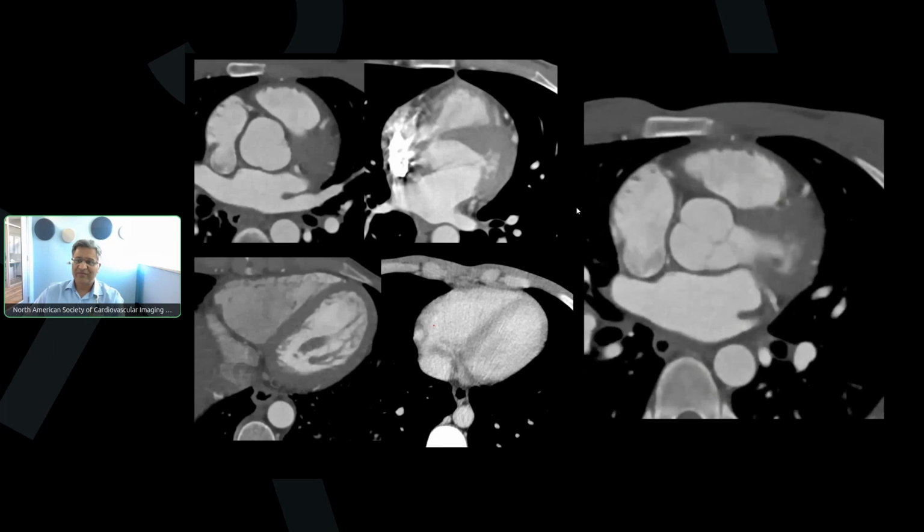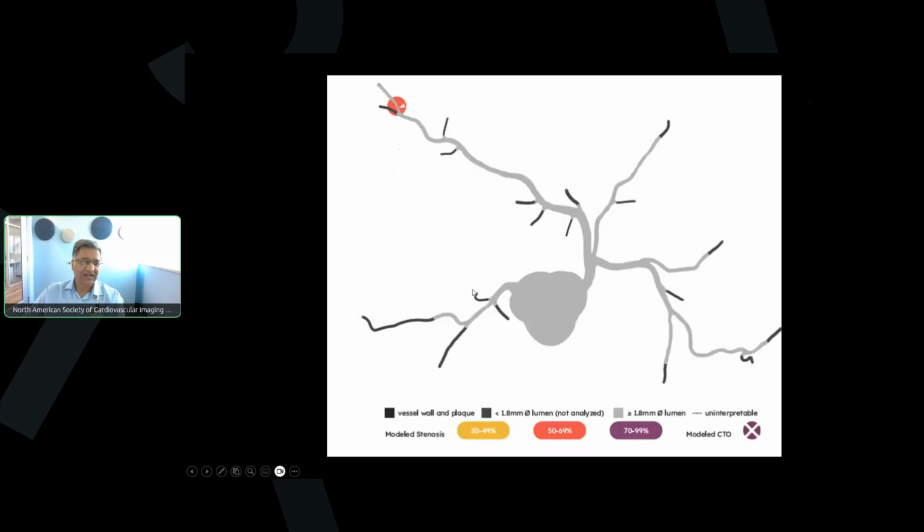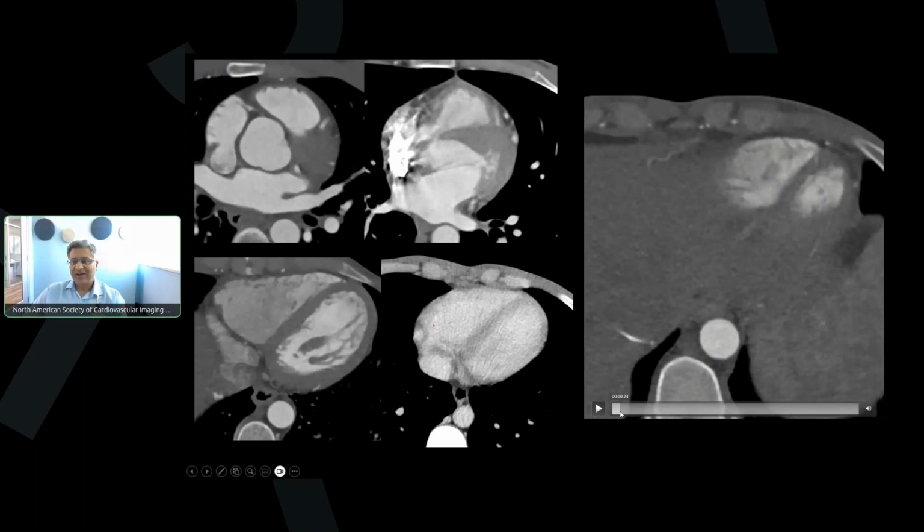So this is our follow-up imaging. These are the two images from the initial scan, and then these are the CT images from the follow-up. Again, you can see that the aneurysm is much smaller in size. Same thing over here, and this one is also smaller in size and probably thrombosed or no longer opacified with contrast. We can see the same findings over here.